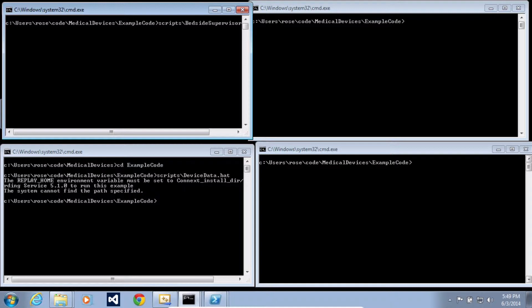This is the recorded data from two different simulated sensor applications and it has been modified to cause an alarm condition. This replays this data using the RTI Replay Service application.